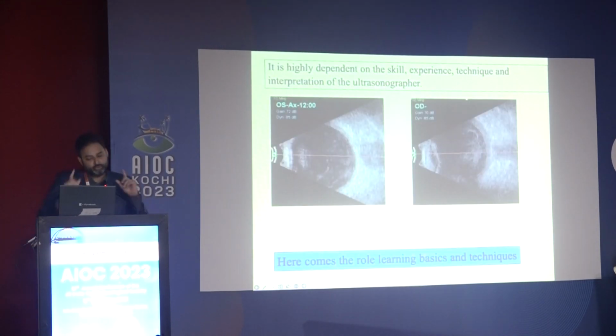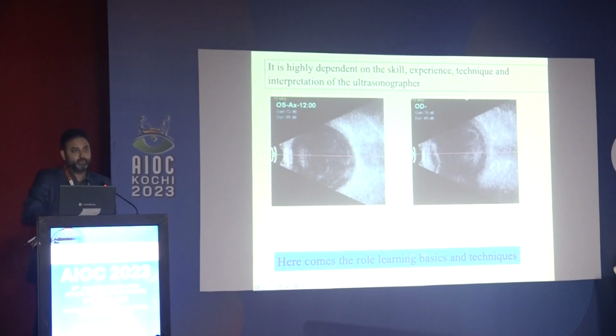So typically, the beauty and the issue with the ultrasound is that it's operator dependent. It's not like an X-ray or a CT scan film that you get and everybody gets to see the same image. If I do an ultrasound, it might be exquisitely poor. Whereas if someone on the panel does it, I'm pretty sure they'll be able to pick up a lot more because they're more experienced, they're better. So it's operator dependent, it's skill dependent. It'll show you what your mind wants to try and see.